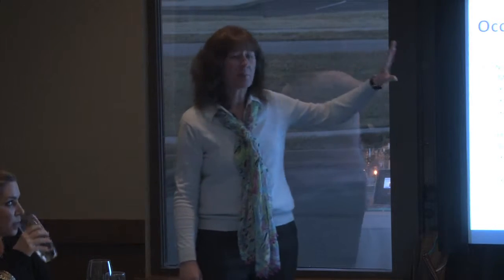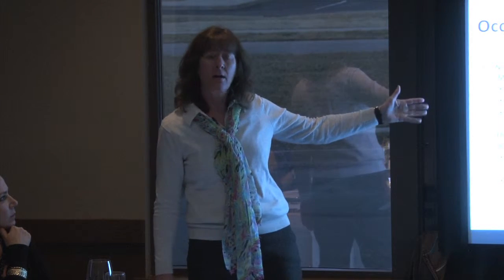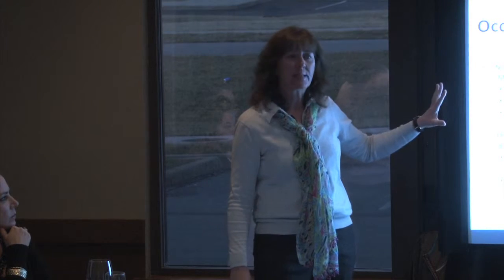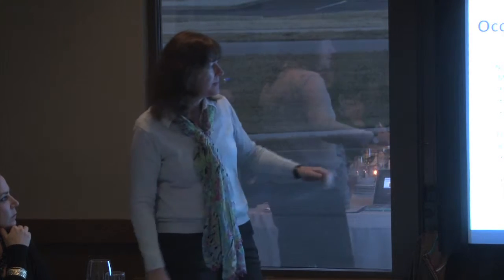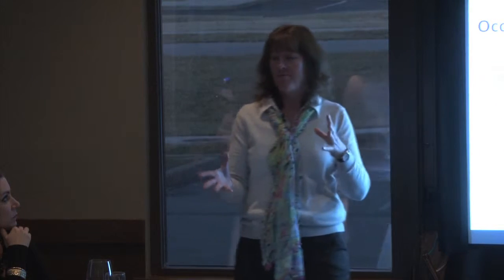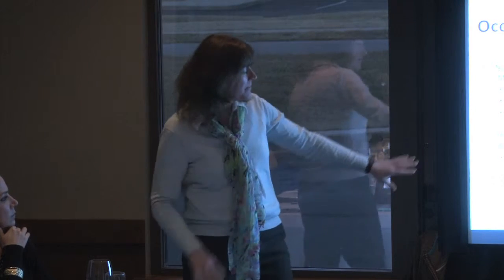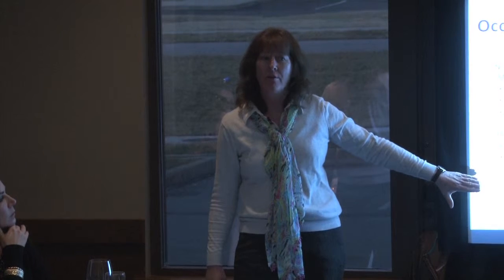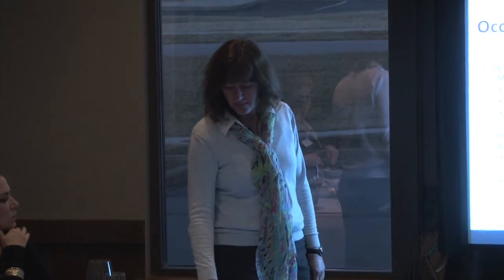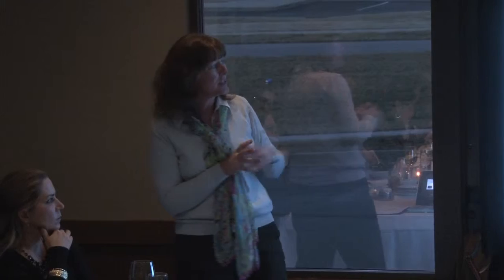The different occlusion types: we have non-thrombotic and thrombotic occlusions. Our non-thrombotic occlusions are the lipid or chemical aggregates, precipitate, the kinked catheters. Our thrombotic occlusions are the biologic, blood-related. We can have intraluminal thrombus and extraluminal, and that extraluminal, pardon me, consists of fibrin sheath or mural thrombus. That fibrin accumulation can initiate inside of the catheter tip, and it is often the result of blood reflux back up into the catheter tip that starts that whole process going.